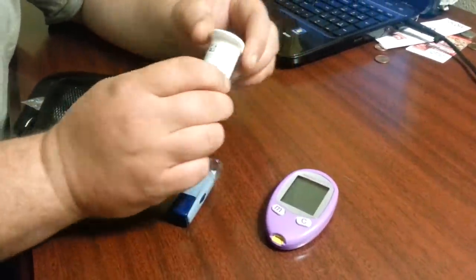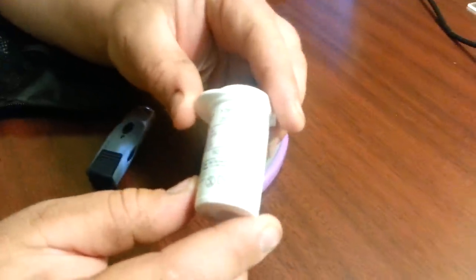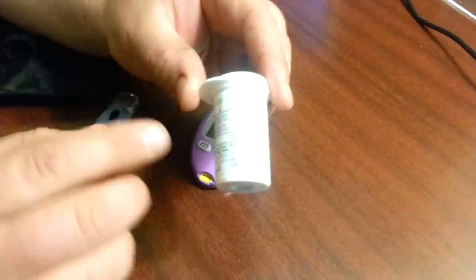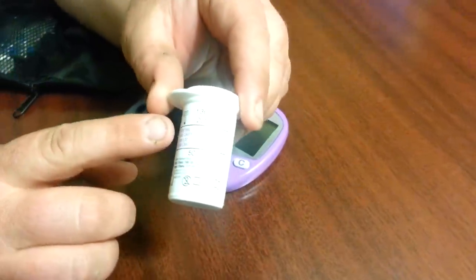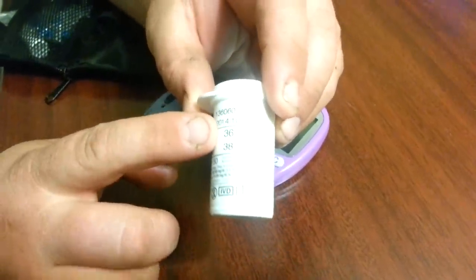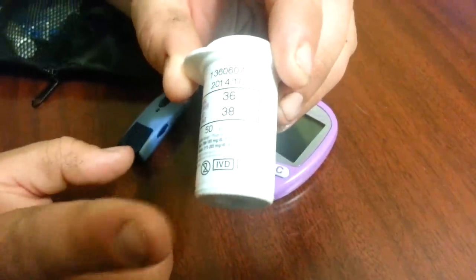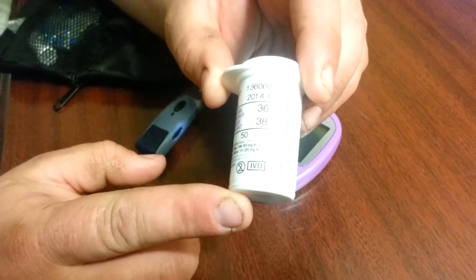First thing you want to do is look at your test strips. Now the difference between this and a human monitor is these are coded for dogs and cats. Simply by looking on the bottle you'll see the code for dog, which happens to be 36. Every box or vial you get usually has a different code, so you have to make sure that you set that.